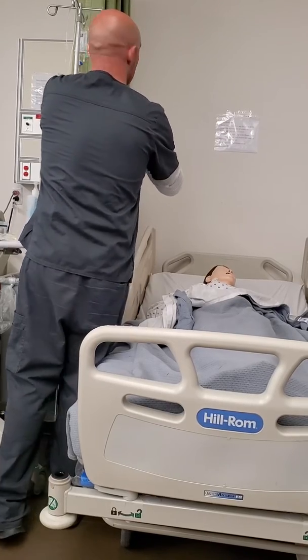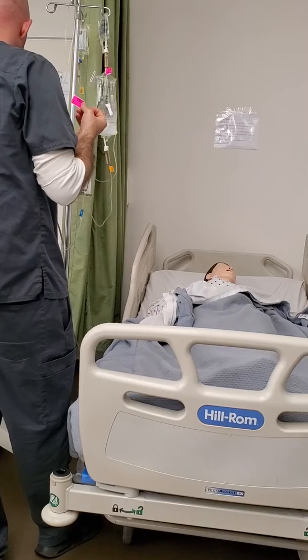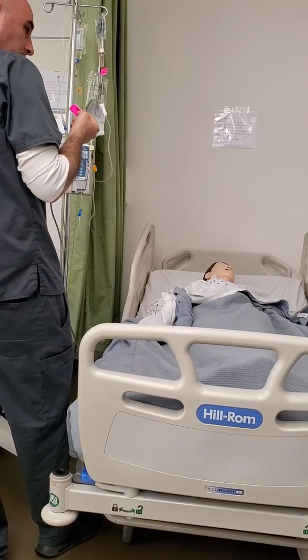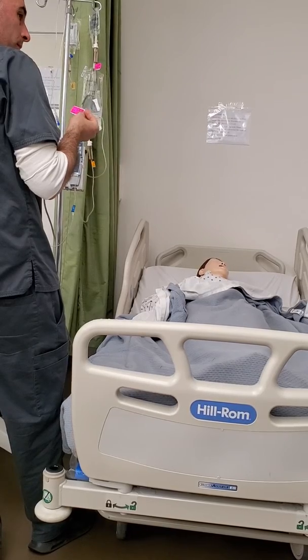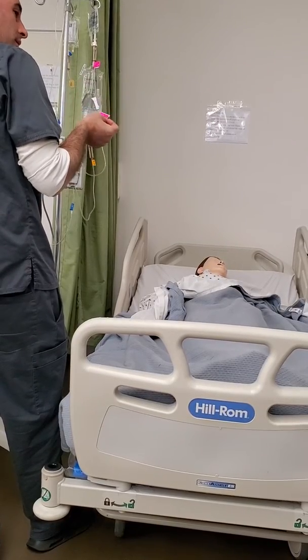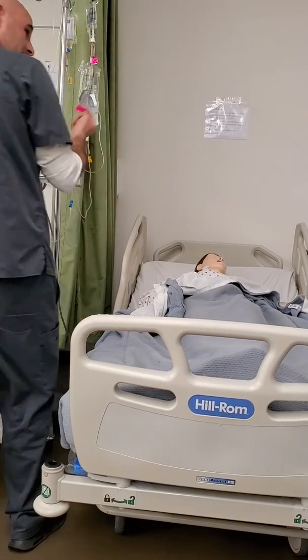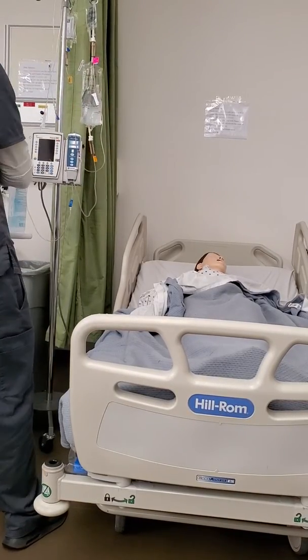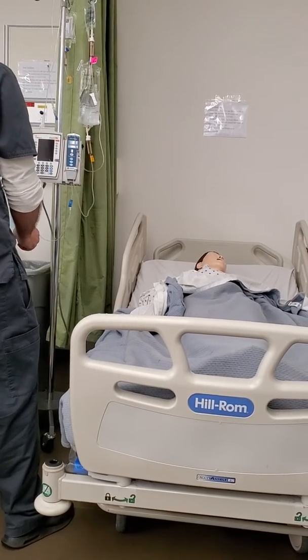Those labels are just for tubing. In the clinical setting, they've got little envelope labels, small ones. You would just grab those and stick it on the bag and just date, time and initial. That's just for the tubing. Okay, we just discussed this half hour ago with the instructor, who knew this too, and I did the same thing. So I'll get the right tab for future use.